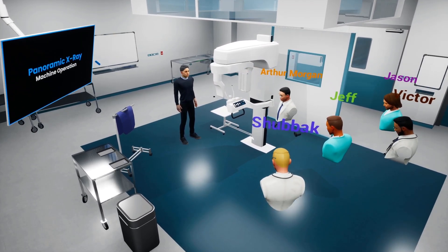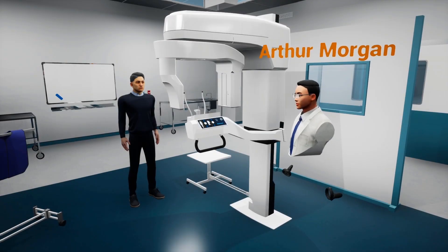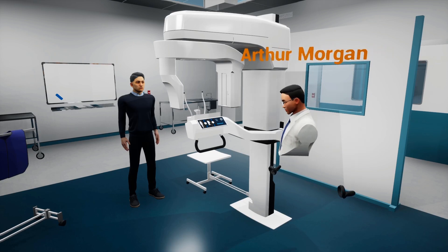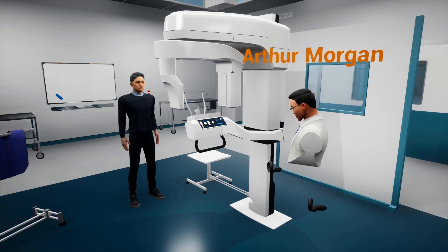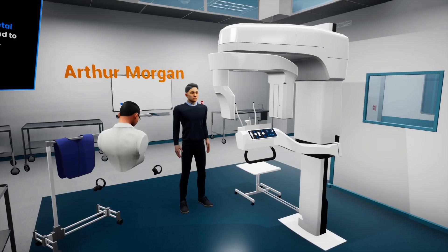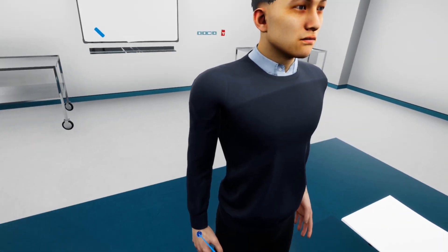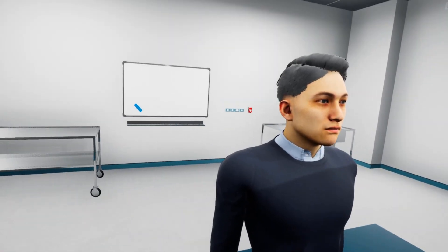Thank you all for attending the Panoramic X-Ray Machine Operation Guide in VR. Let us begin right away with what we need to do prior to taking images. The first thing to do is to ask the patient to remove any metallic objects that he has on him from the shoulder up.